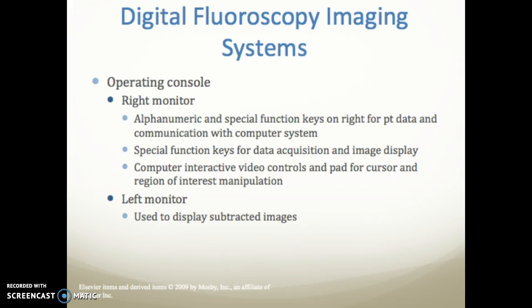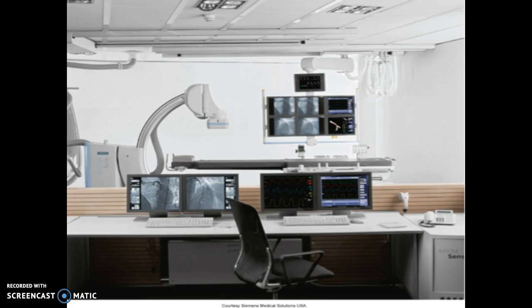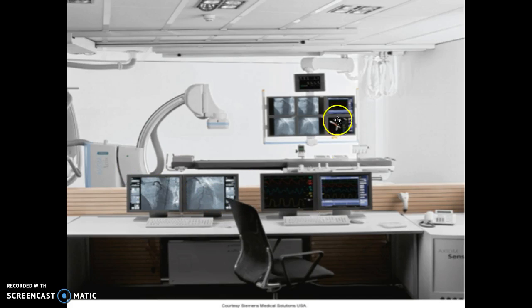The left side of the monitor is used to display the subtracted images. Here are the controls and the subtracted images displayed within the control room.